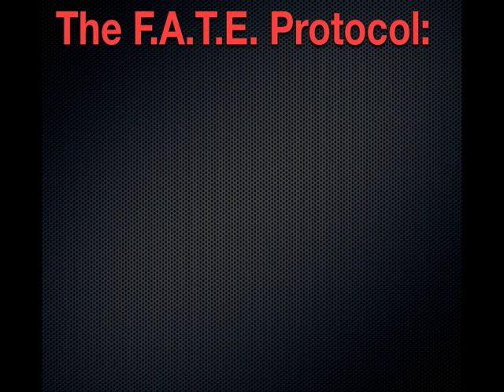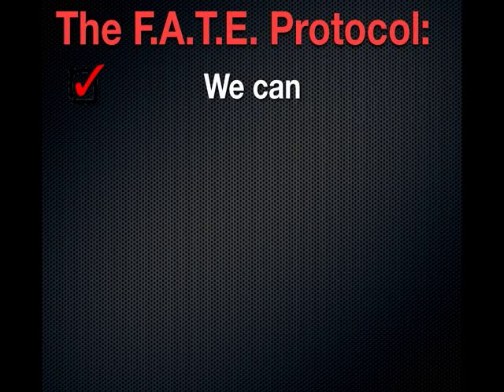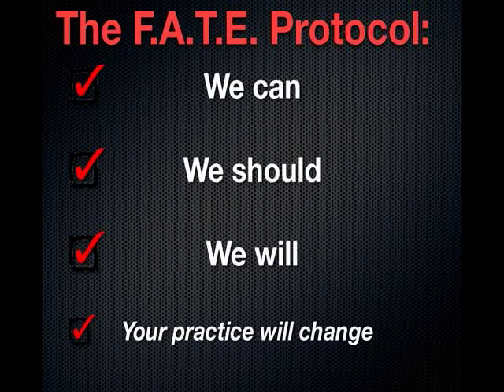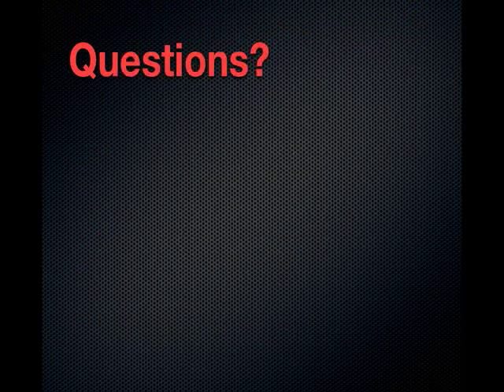So the FATE protocol, to reiterate, is fairly easy. We can do it. It's not hard to learn. We should be doing this. All of the critical care consensus statements say that this is no longer optional in the care of very seriously ill patients. And we will be doing it. I think it's on the boards now. It's considered mandatory in critical care curriculum. And I do believe that once you get comfortable with this, your practice will change.